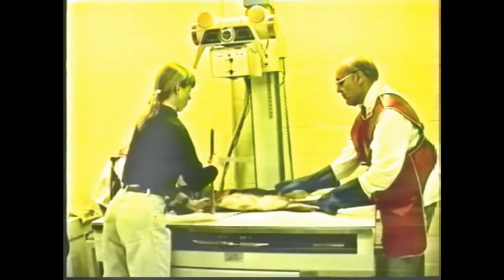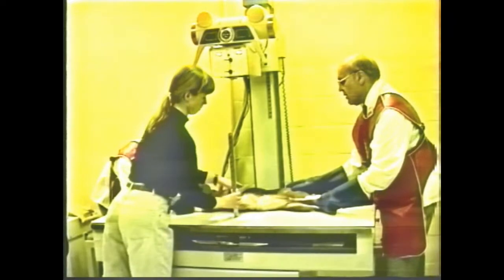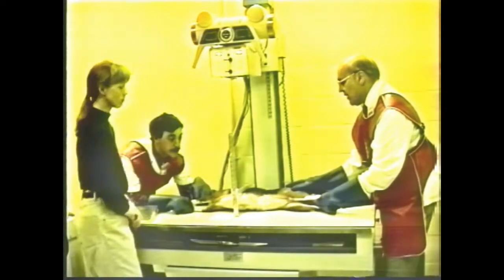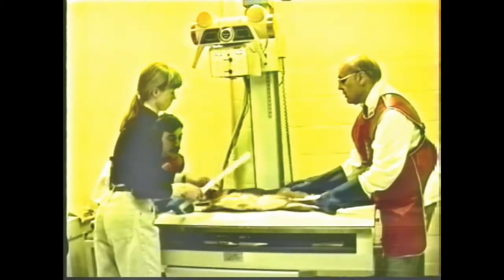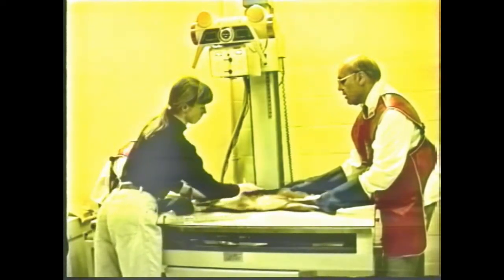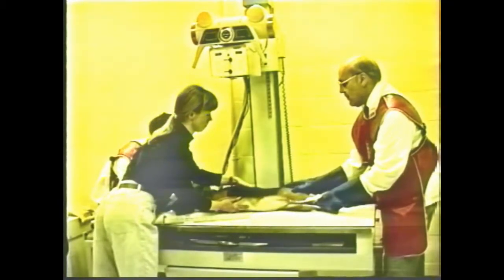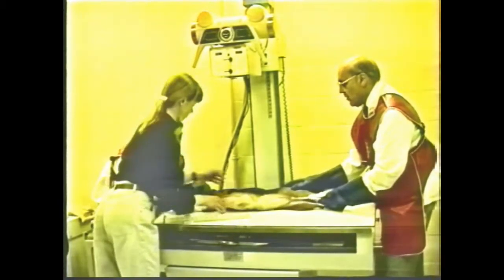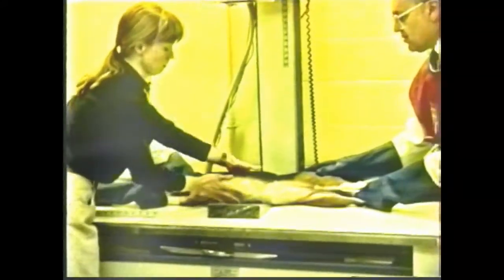The animal is placed in right lateral recumbency. The forelegs must be pulled and extended cranial. The rear legs are pulled caudally to place a slight tension on the thorax. The head must be maintained in a neutral lateral position so that the cranial thorax is not twisted.